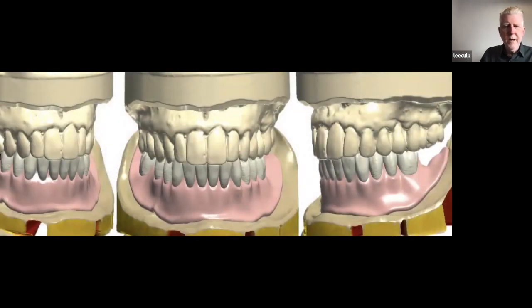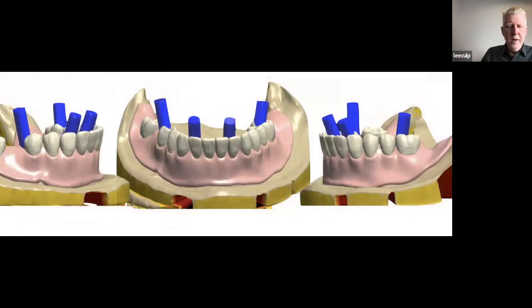So starting with a denture design. Even though we're going to get all this scanned in, we're going to put it all together. So the denture design to the upper. And on this case, we actually did this one slightly backwards, because we were working on the case, and before we even got to the planning, Lyndon goes, well, this is where I'd really like the implant holes to come out.